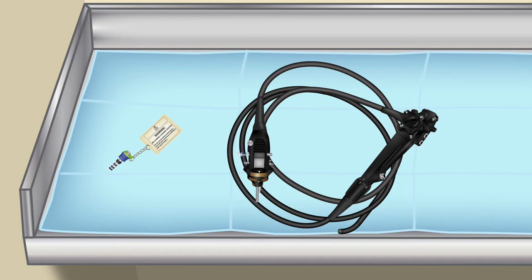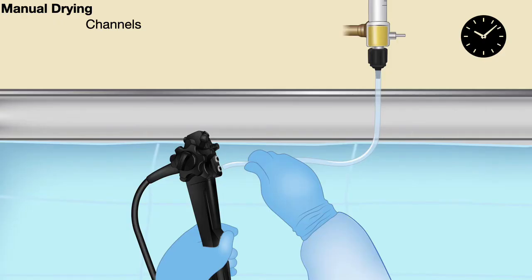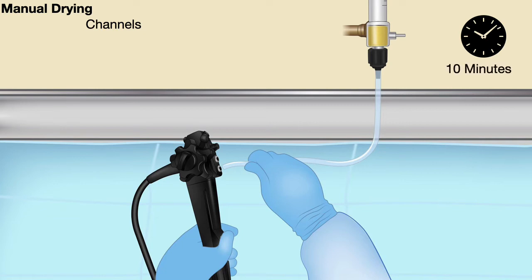We go with the manual drying of the channels by blowing filtered air through the different channels for a minimum of 10 minutes.